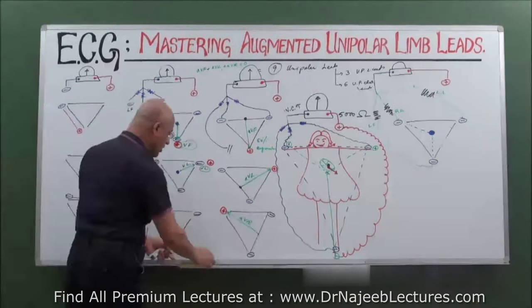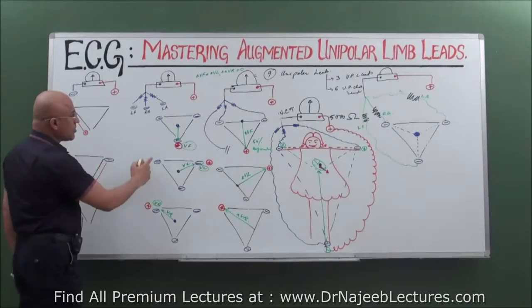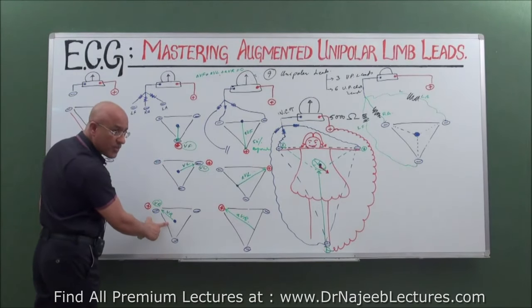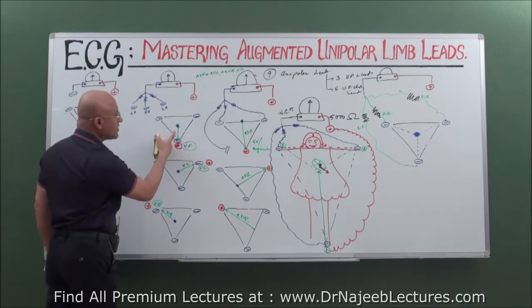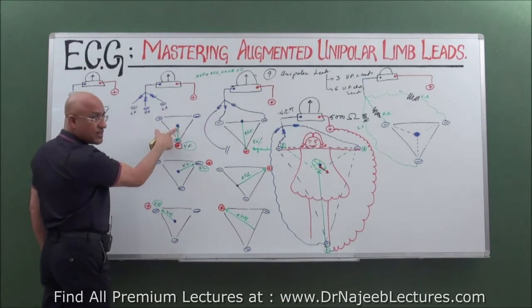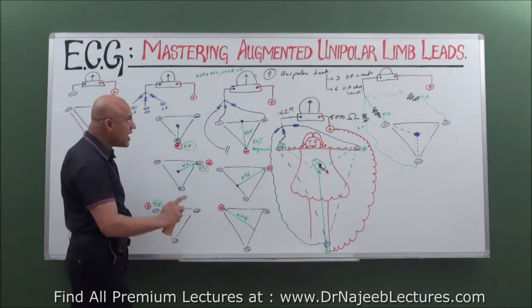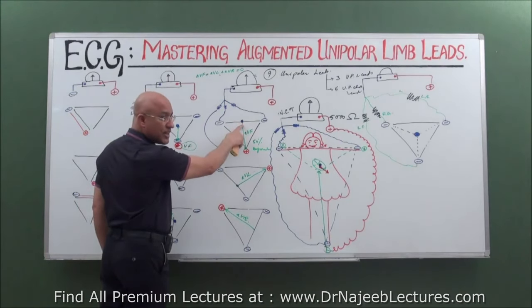Now onward, what I'm going to talk about is that in case of limb leads, originally VF, VL and VR were made, but they are no more used. Now, in place of them, rather than the Wilson central terminal, where the indifferent electrode is fixed, we have the Goldberger central terminal, where this is mobile. What is this? Indifferent electrode.